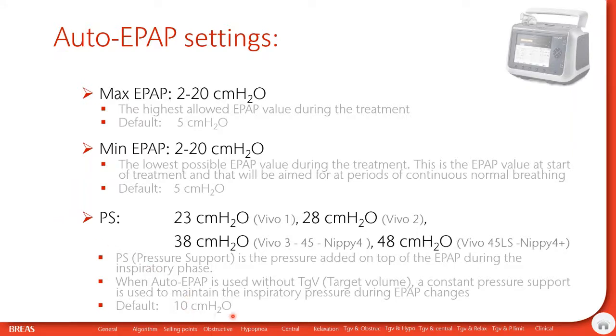The default value is 10 centimeters of water, meaning that the peak inspiratory pressure being delivered during inspiration will be 10 centimeters of water above the actual EPAP.